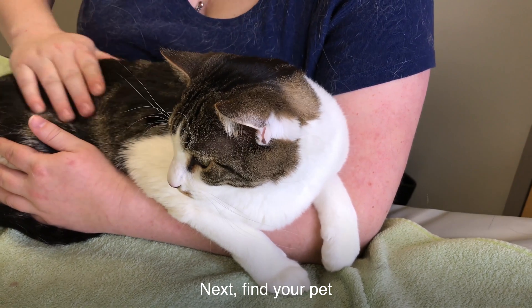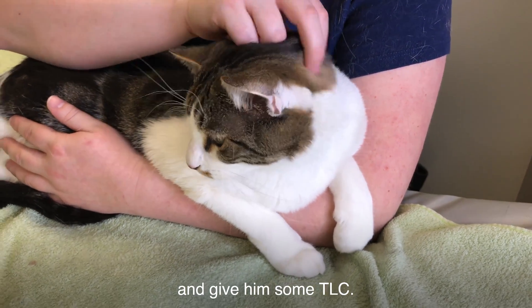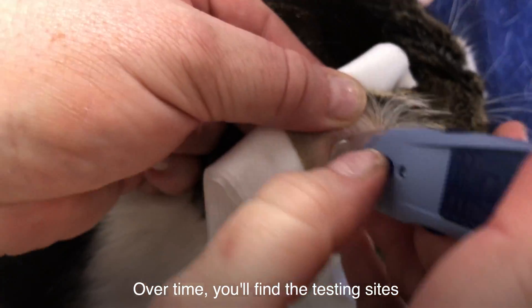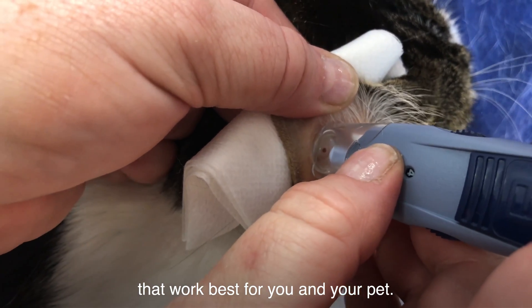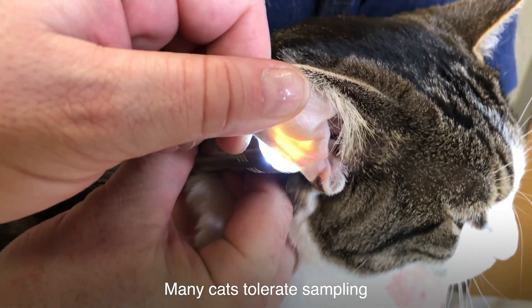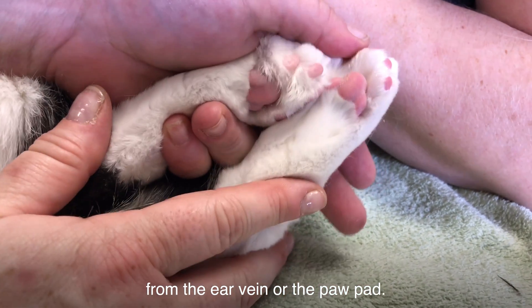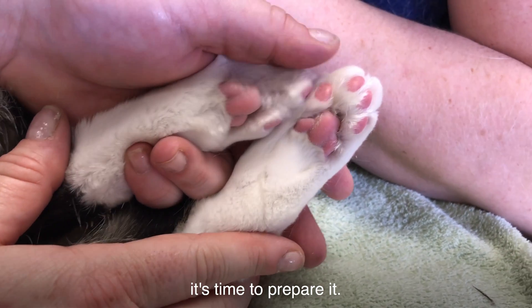Next, find your pet and give him some TLC. It's important to associate testing times with love and attention. Over time, you'll find the testing sites that work best for you and your pet. Many cats tolerate sampling from the ear vein or the paw pad. Once you've picked the testing site, it's time to prepare it.